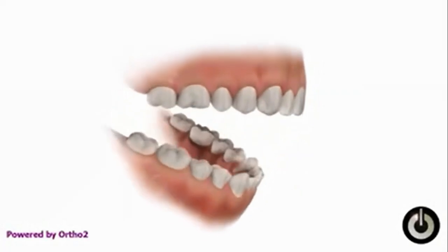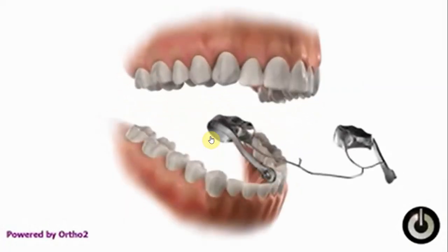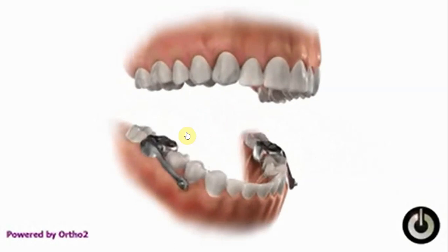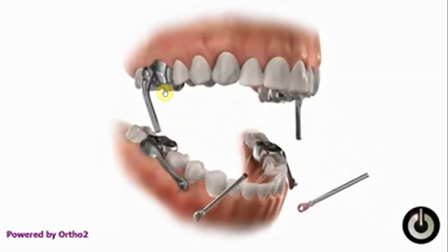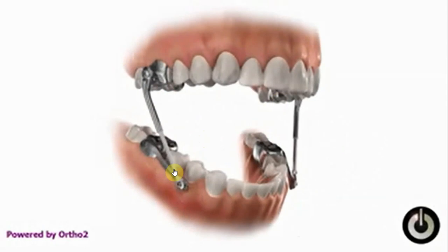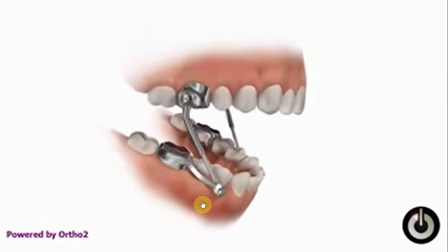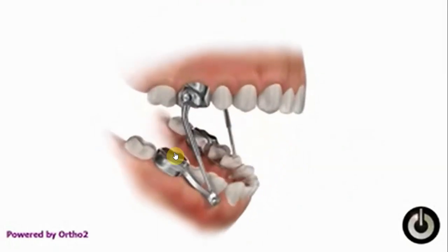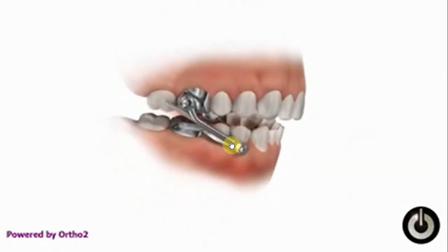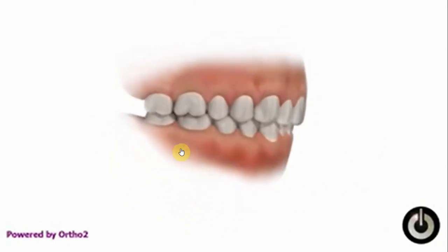Yeah, so this one is also a fixed appliance. Again, I'm giving it in a Class 2 patient. So these are the bands, molar bands. I can put it in the mandible. I am going to put GIC around the molar band and cement them. So it is fixed. So you have a screw and a piston. You tighten it with a screw here, and it's a very rigid, crude way, and you're forcing the patient to bite in a forward position. So this is a rigid, fixed, functional appliance.